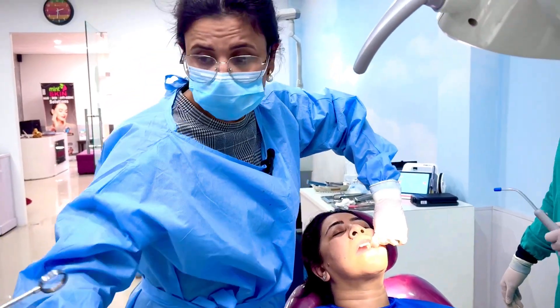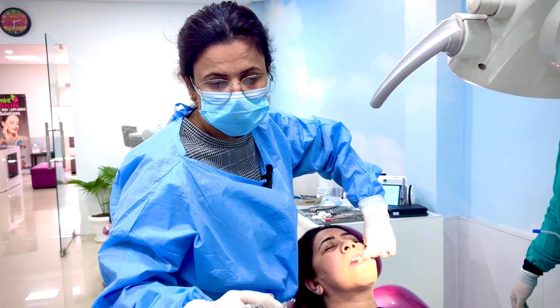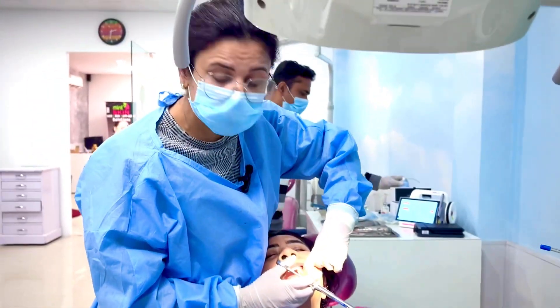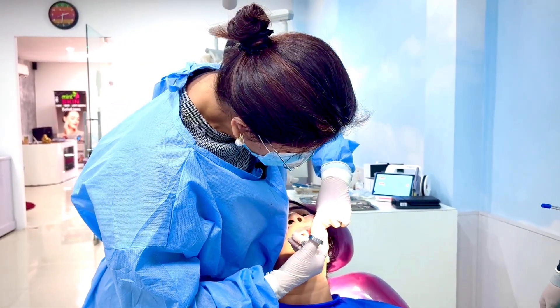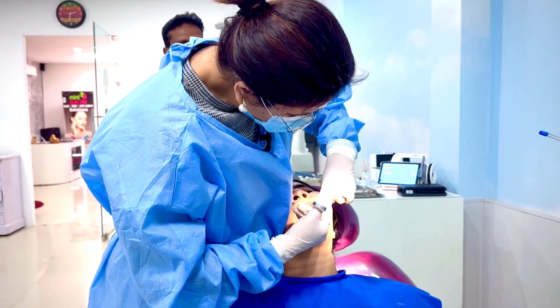Giving the posterior superior alveolar nerve block. After the spray, the needle will go at 45 degrees to the second molar, just beyond the zygomatic buttress. Okay, slowly, slowly.